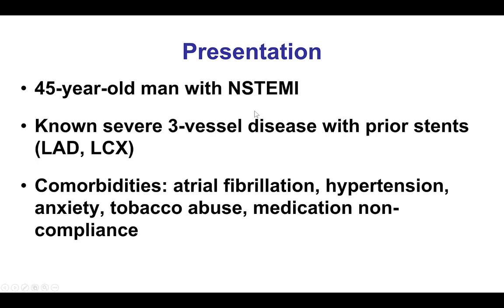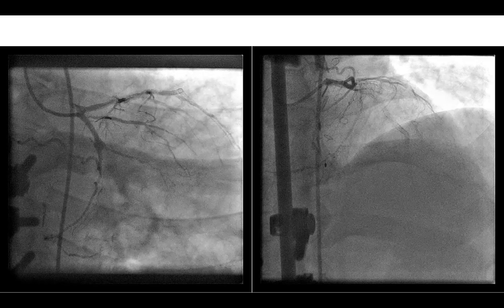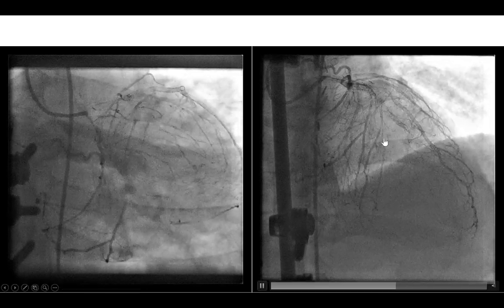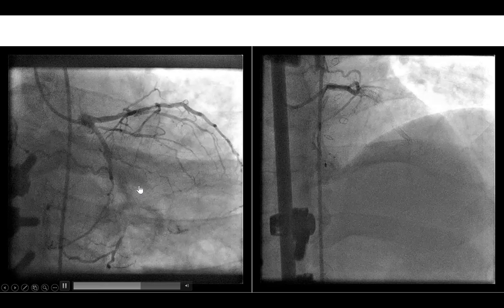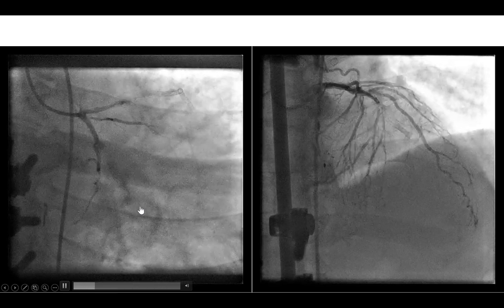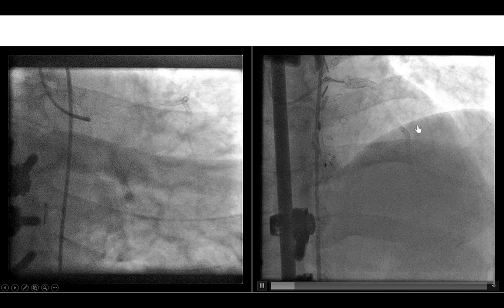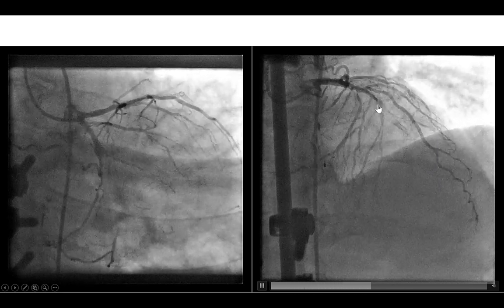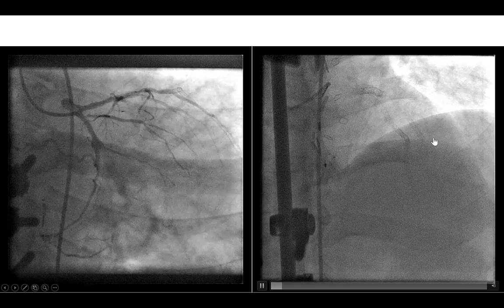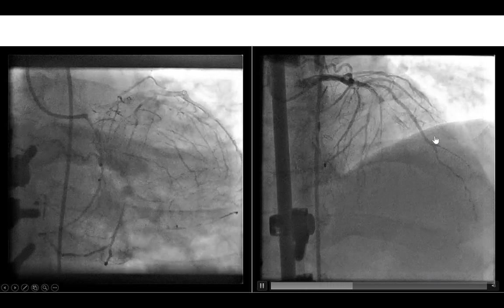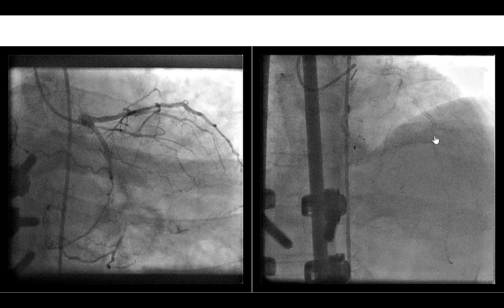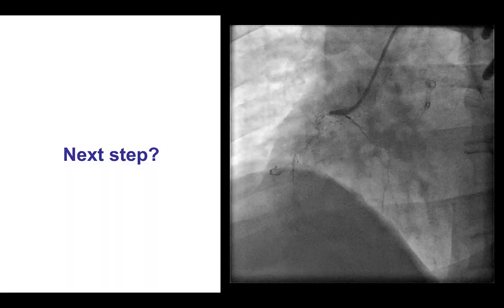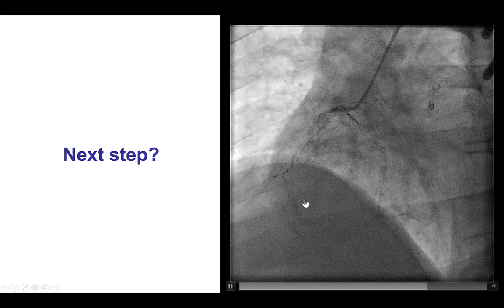The patient presented with non-ST elevation myocardial infarction. He had known severe three-vessel coronary disease and had stents in the LAD and the circumflex, as well as multiple comorbidities. Coronary angiography demonstrated occlusion of the LAD. There was also occlusion of the obtuse marginal at the site of the previous stent, and potentially a filling defect in the LAD, suggesting that the occlusion may not be chronic but was potentially the culprit for the NSTEMI. There was also an occlusion of the right coronary artery.